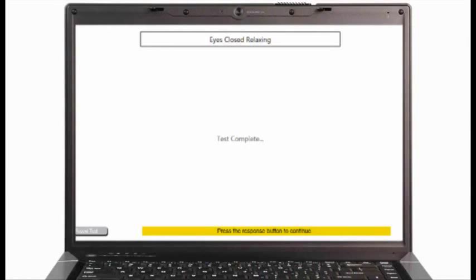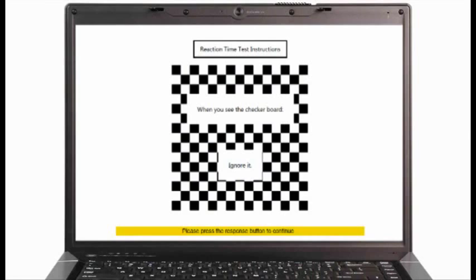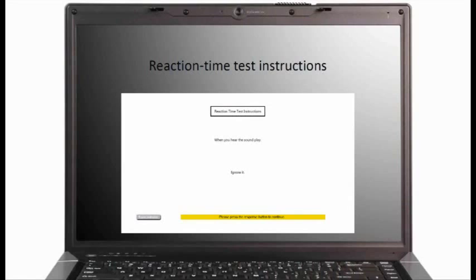Last part, the evoke potential portion. You'll follow the instructions. When you see the large circle, you will press the button as quickly as you can, only for the large circle. When you see the small circle, you're going to ignore it. When you see this checkerboard, you're going to ignore it. When you hear that noise through your earbuds, the white noise stimulus, you're going to ignore it. It is quite loud, about 85 decibels. This will be a practice test.